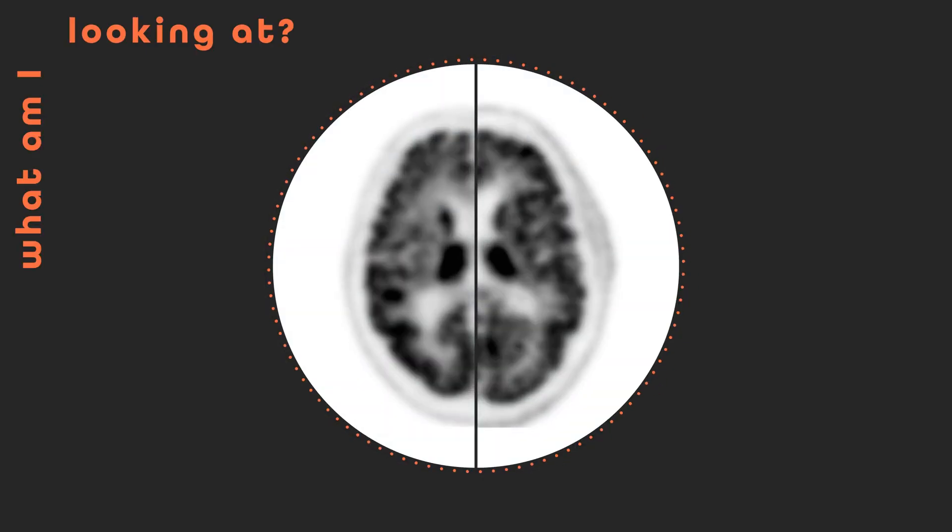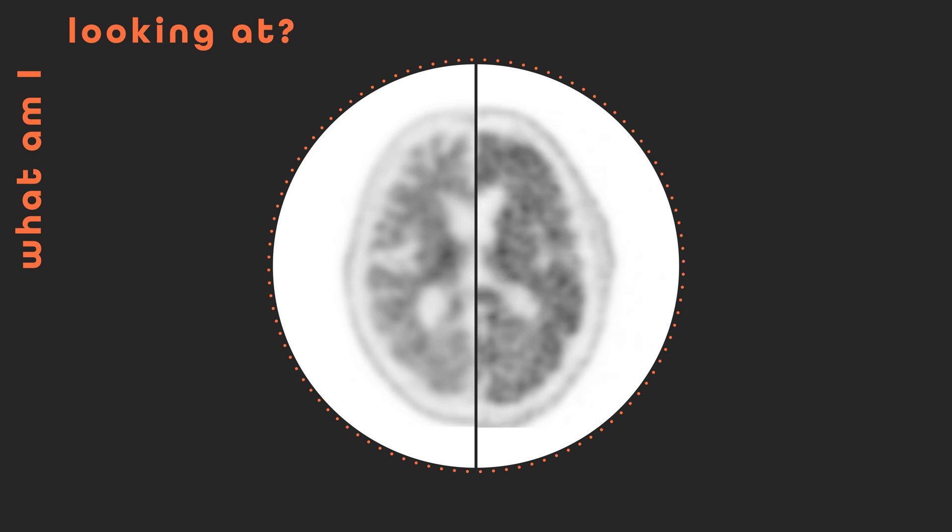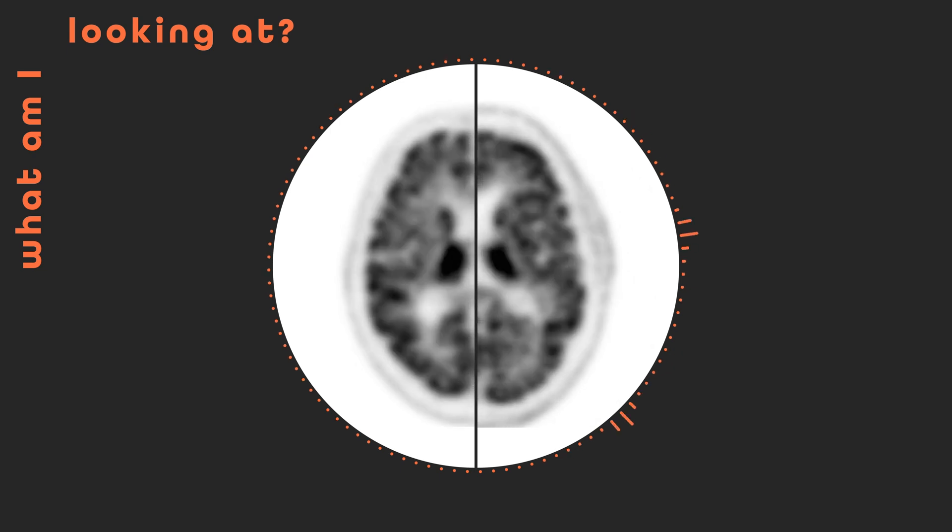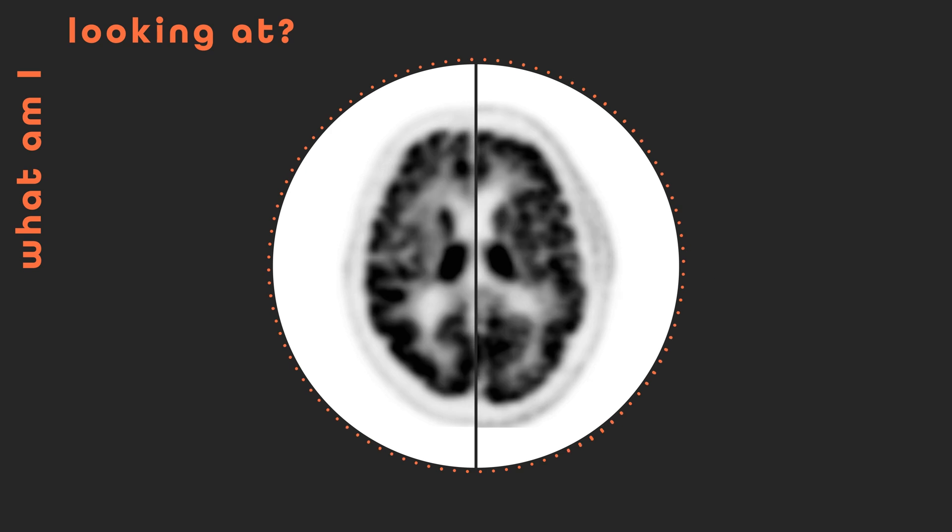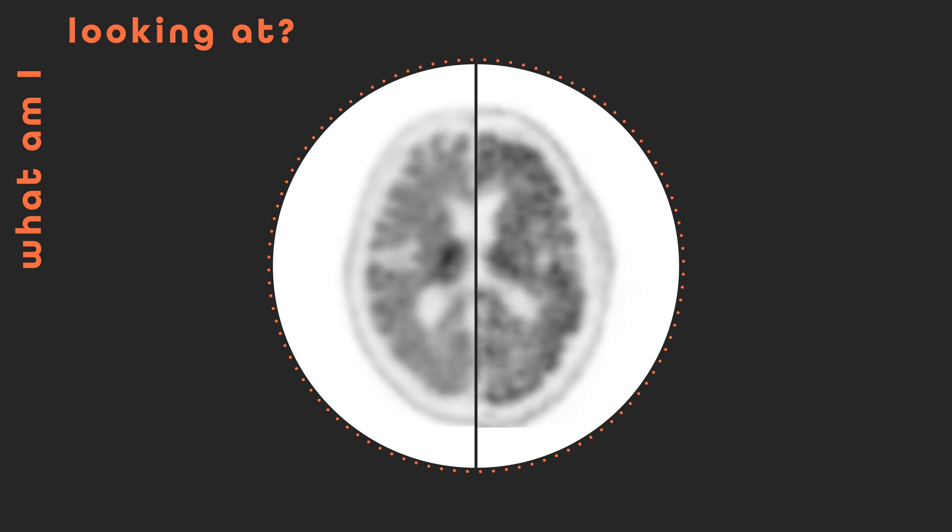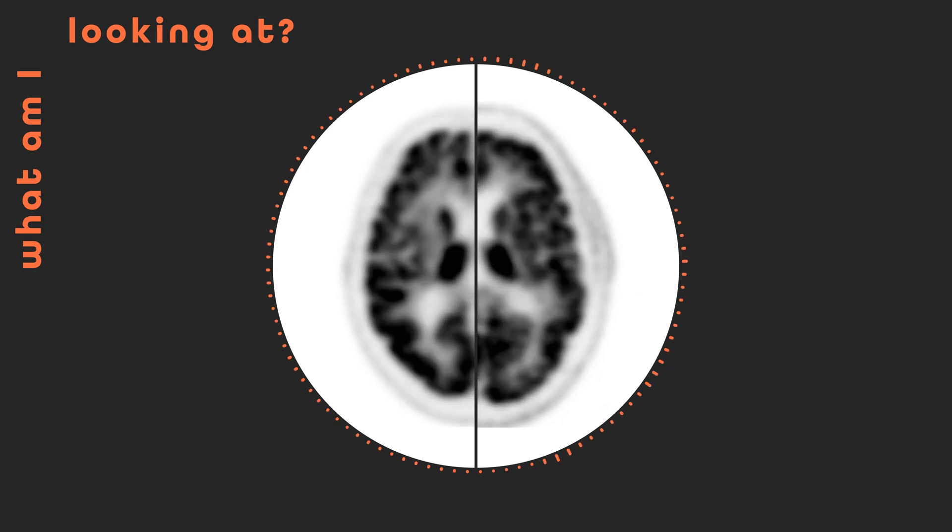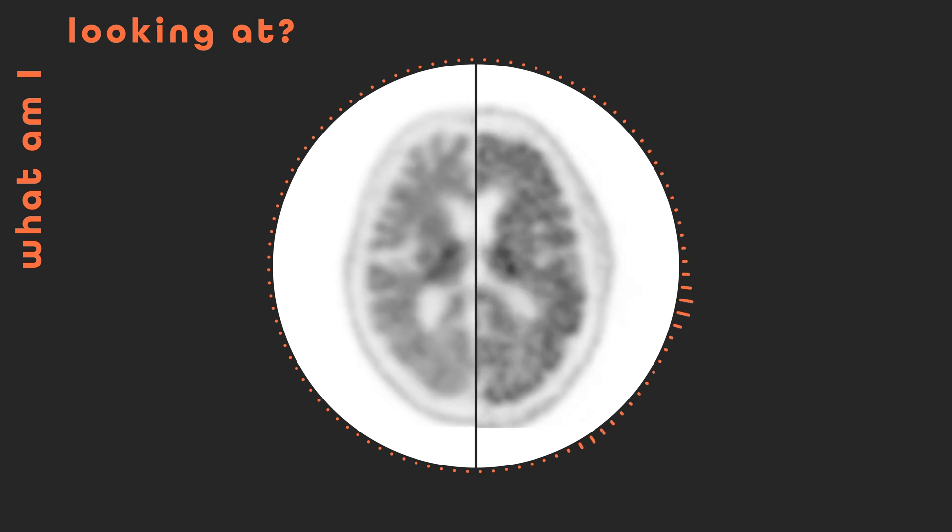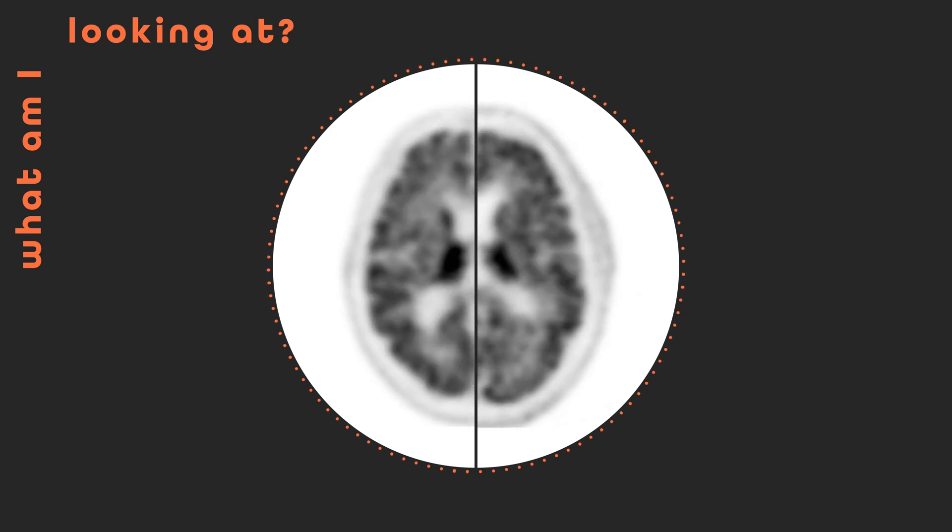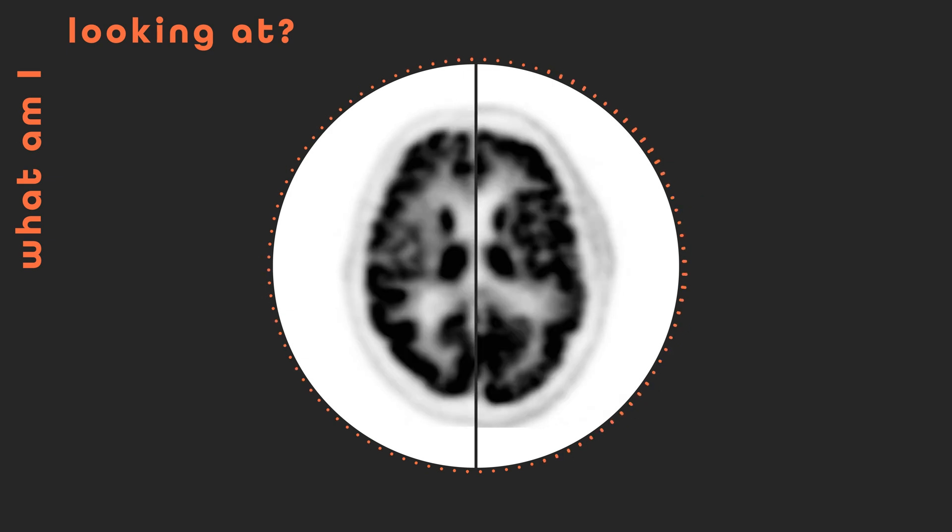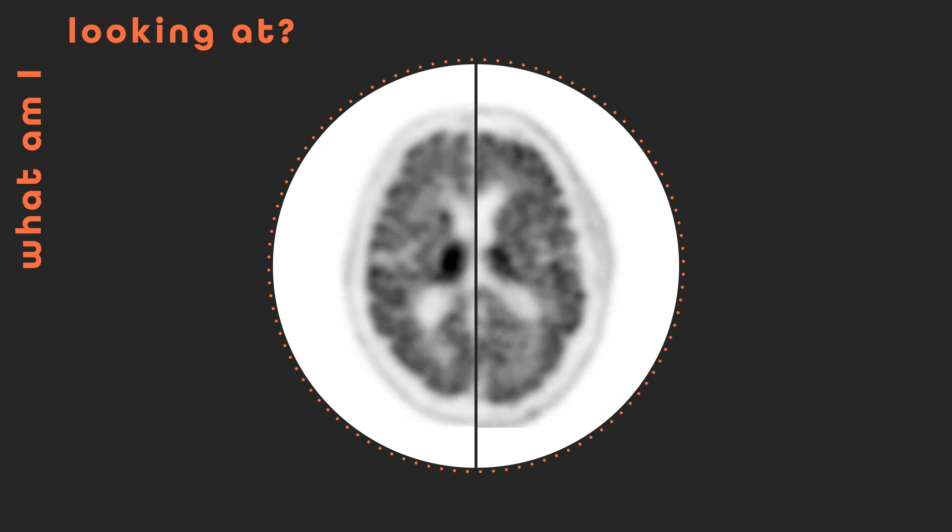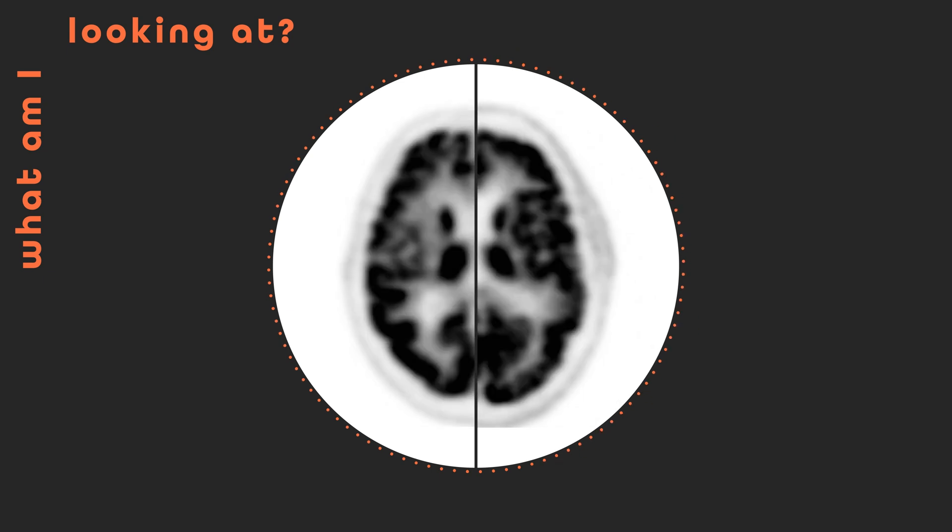No prizes on offer for identifying a brain. But in fact, what you're looking at are two brains rather than one. Each brain half belongs to a different patient. This video captures how the concentration of a special radioactive tracer changes over a 60-minute period after intravenous injection. The darker the area, the more tracer there is.